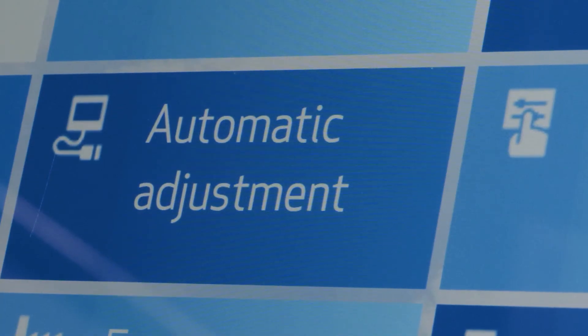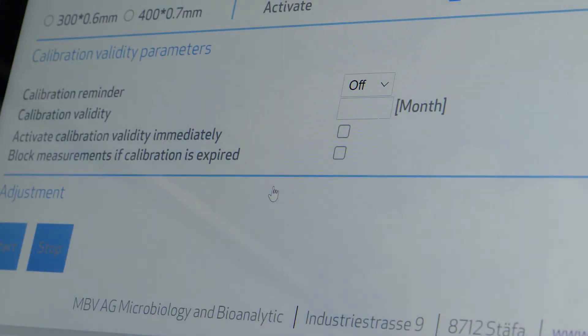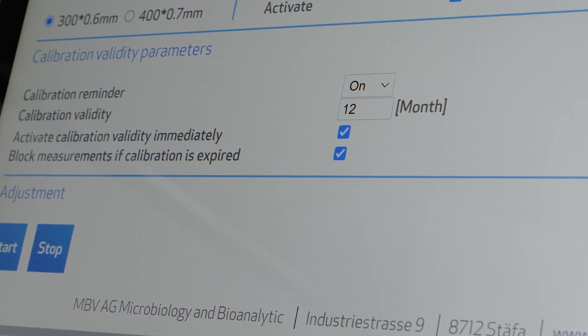The calibration reminder counts down and reminds you of timely recalibration. In the configuration, you can even choose to block the instrument once the calibration reminder has expired. This prevents using the air sampler in a non-compliant way.